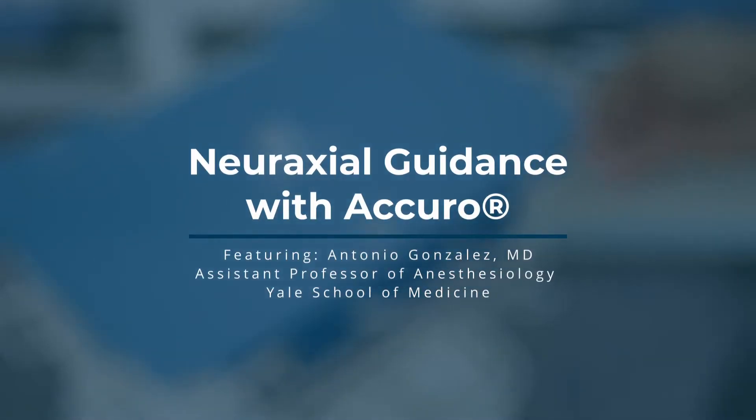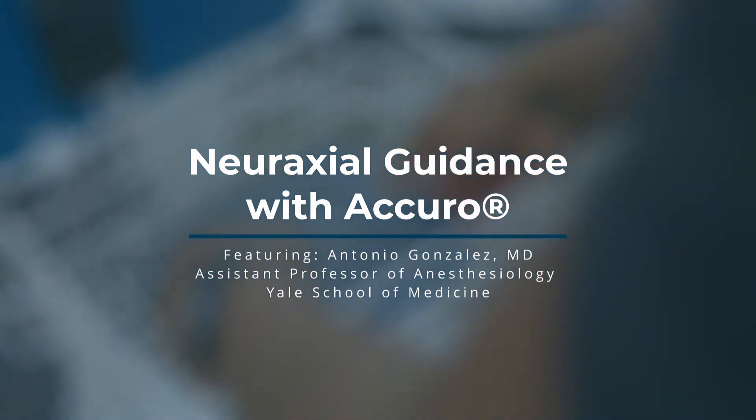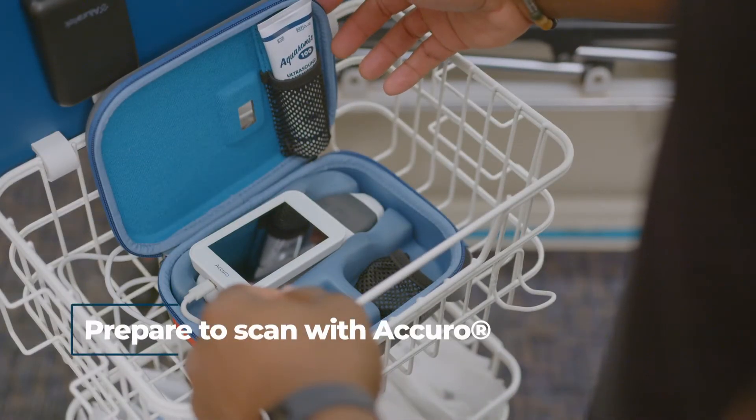Welcome to Neuraxial Guidance with Accuro, featuring Dr. Antonio Gonzalez. Prepare to scan with Accuro.